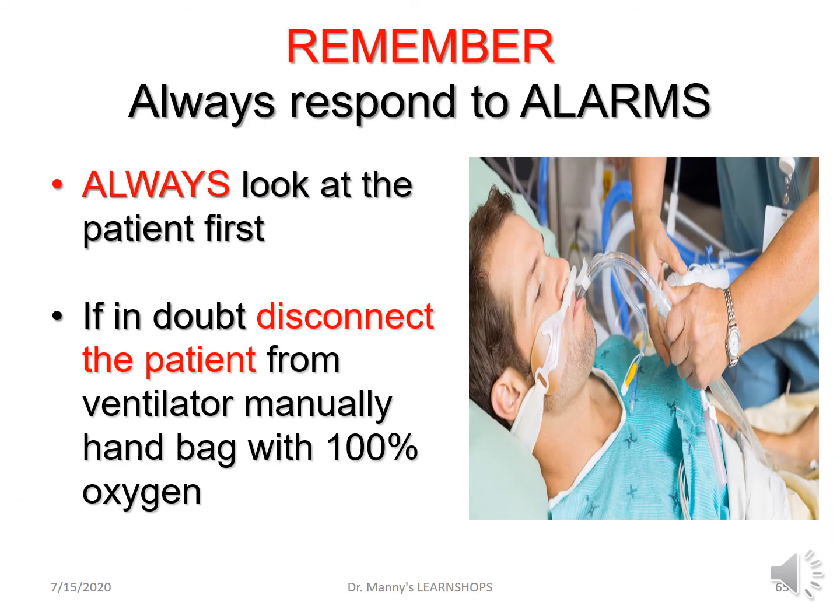When it comes to alarms, always remember to respond to alarms. Don't become complacent. However, always look at the patient first, and if in doubt, and you're permitted to do so, disconnect the patient from the ventilator manually and handbag with 100% oxygen until someone who's an authority comes to assist you. Whether it's a respiratory therapist in some countries, whether it's your immediate supervisor, preceptor, whether it's now the physician or the intensivist.